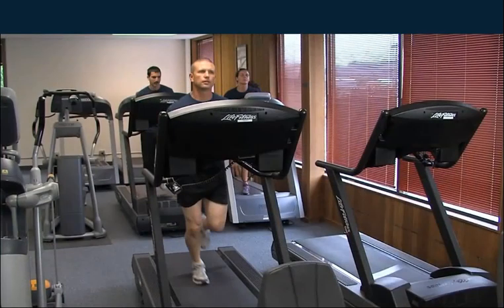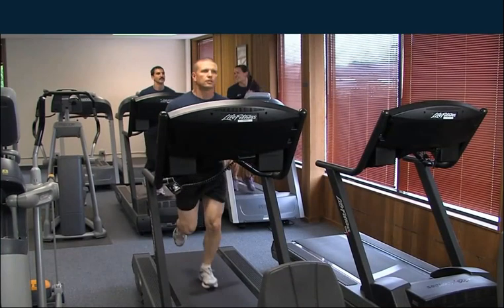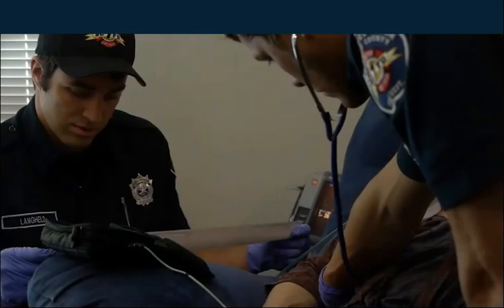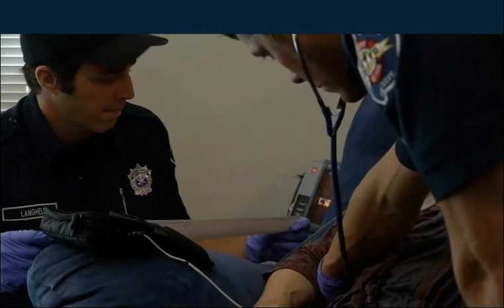If I overventilate myself on purpose and I'm breathing fast, obviously then I'm blowing off that CO2 at a greater rate than which my body is producing it. So when we look at ventilation specific with capnography, if we have someone who's breathing at a respiratory rate of 30 or 40 and they have an end tidal between that 35 to 45 range, we know that respiratory rate is compensatory for some increased metabolic production. By using capnography, a responder can quickly identify when a patient's metabolism, perfusion, or ventilation may be signaling a serious condition.